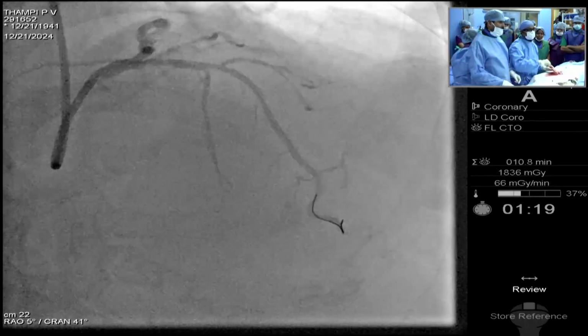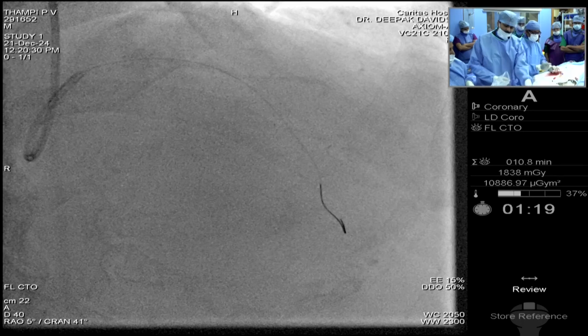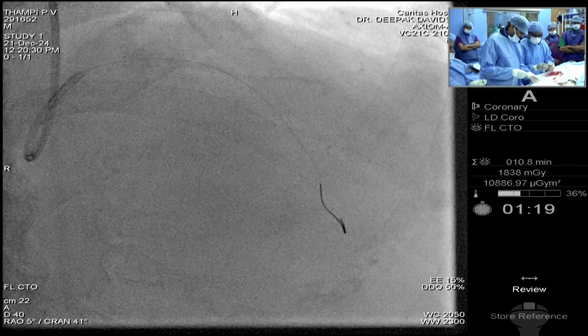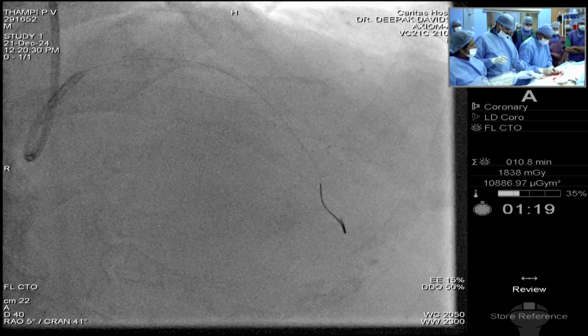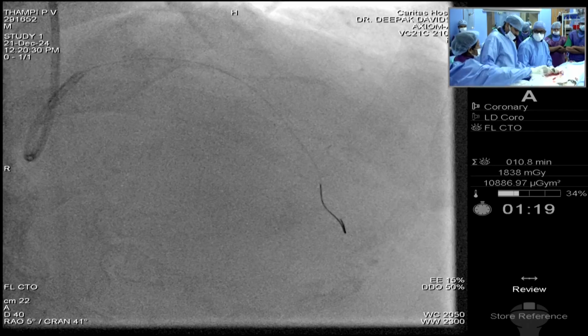Stop. OCT catheter. We'll do OCT. See the vessel size. Probably we'll pre-dilate with a 2.75 balloon. Be ready with a 2.75 balloon, 2.75 into 12. Prior to that, we'll have the vessel size assessed on OCT. Aditya, you be ready with the OCT images.